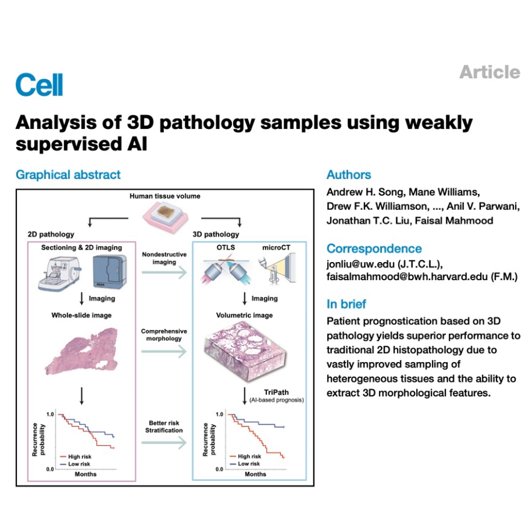Step 2 is feature encoding. Each one of those little 3D instances gets fed into a powerful, pre-trained deep learning model, like a 3D convolutional neural network, CNN, or maybe a 3D vision transformer. The job of this encoder is to compress all the visual information in that patch down into a compact set of numbers, a feature vector. It's a massive compression, like reducing the data per patch by maybe 1,000 times or more. So turning pictures into representative numbers. Got it. Makes the data crunching feasible.